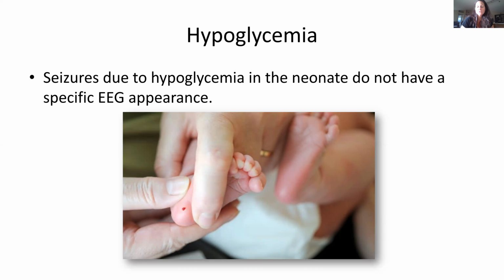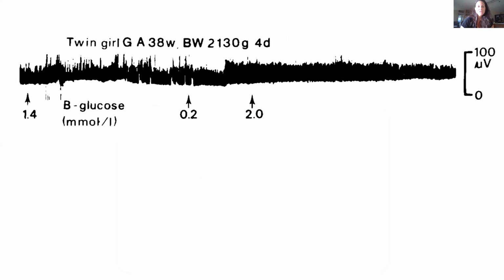And we wonder if babies are not having more transient hypoglycemia than we know. I just recently heard that Sick Kids in Toronto is actually doing continuous EEG, aEEG, along with some continuous blood glucose monitoring, which I find very interesting. I think it's going to be exciting work when they publish that, so that we can begin to see what's actually going on.